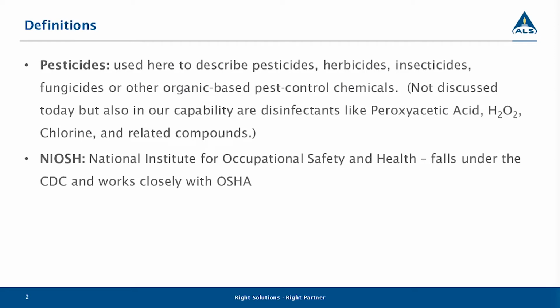The other definition I wanted to discuss, just for those of you who are not aware of what this acronym means, is the acronym NIOSH. And you're going to see this when I talk about the methods named. Some of you who may have some familiarity with other types of methods may be used to terminology like EPA methods or SW methods. The methods we're talking about fall under the NIOSH methods. So that's why I wanted to clarify where that is. They are a research group that publishes methods specific to occupational safety and health.